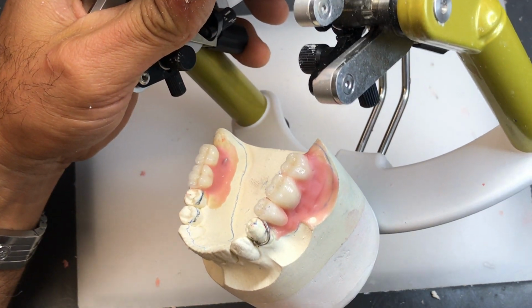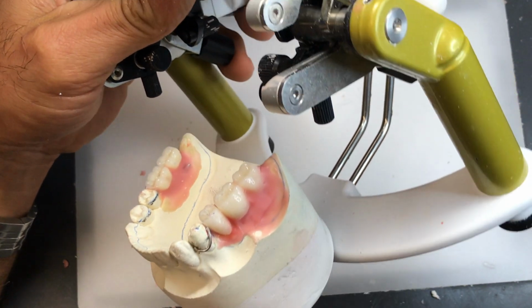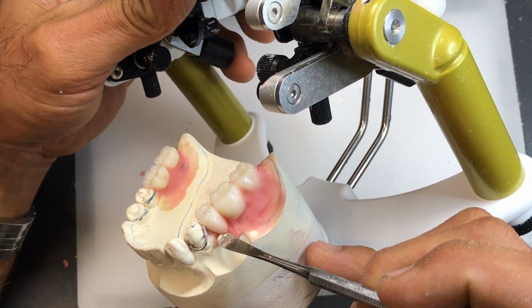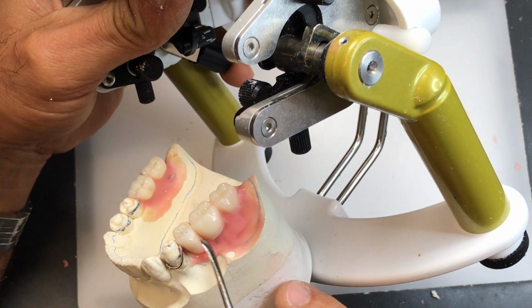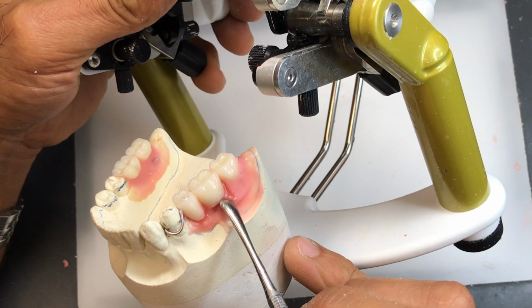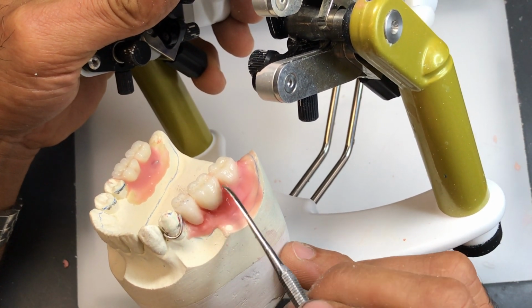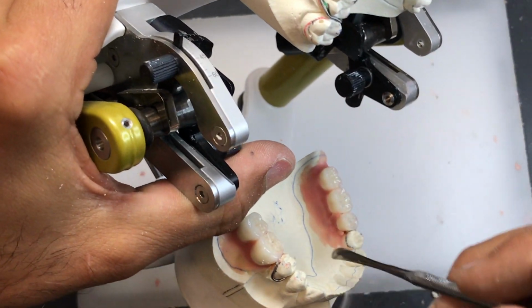So before I do any selective grinding, I want to make sure that everything is sealed down and the wax has cooled off underneath. Otherwise, if you're working with warm wax, you're going to start tapping in the bite and the tooth is going to shift on you. So make sure that your wax is adequately cooled down before you start milling in the bite.